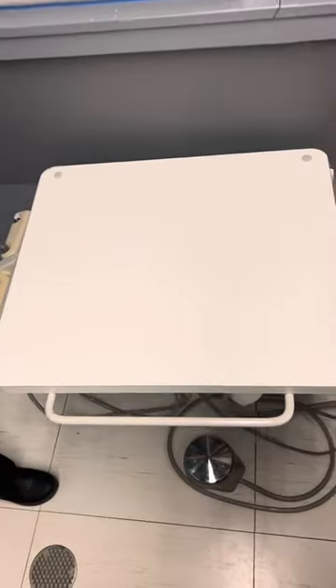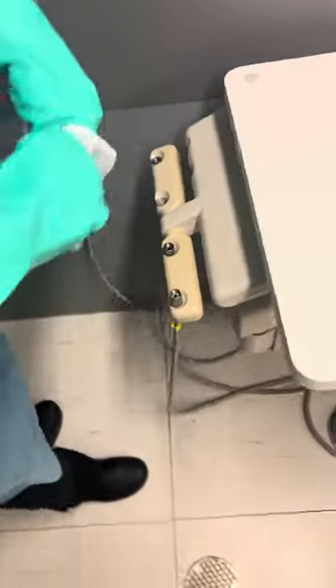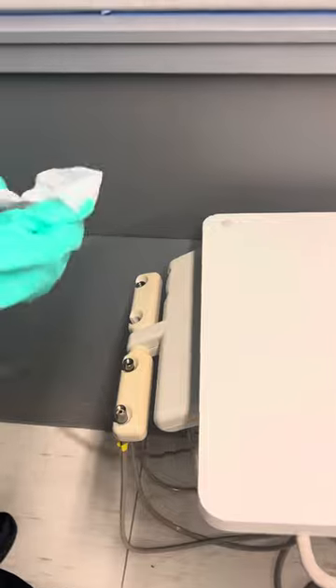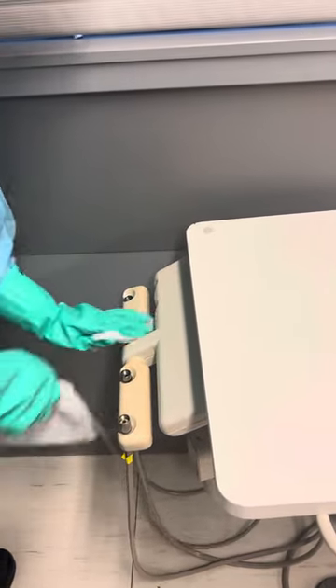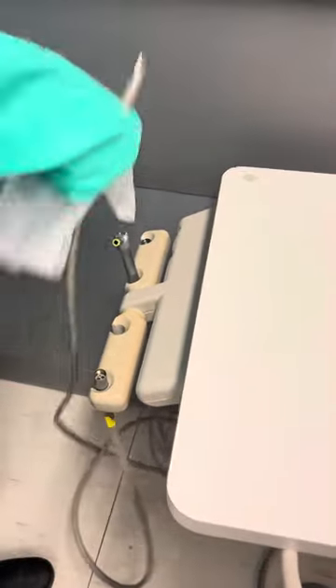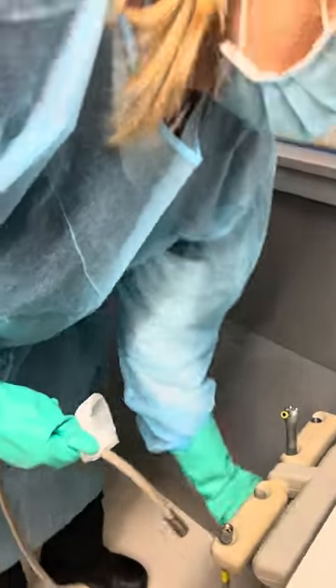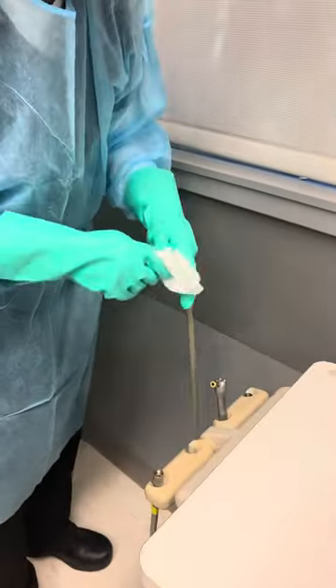Now she's going to the doctor's side. Remember we don't have to wipe the whole thing because it had a barrier on it — we're just grabbing the ones we used because the barrier was covering the other holes. She wipes in the hole, then goes about an arm's length of wiping down the hose — we don't have to wipe the whole entire hose, just about an arm's length.